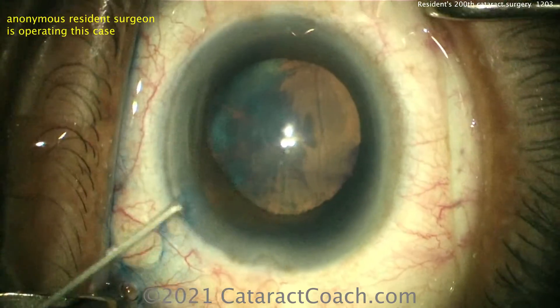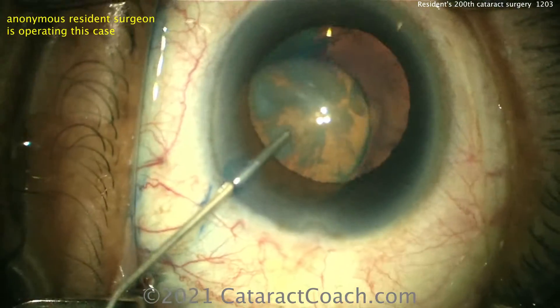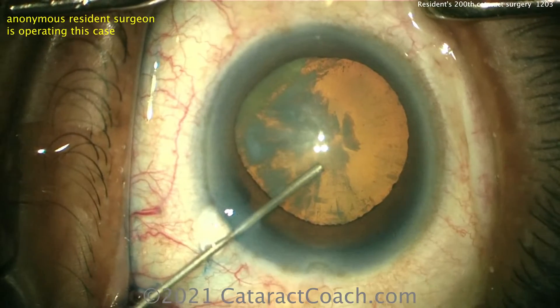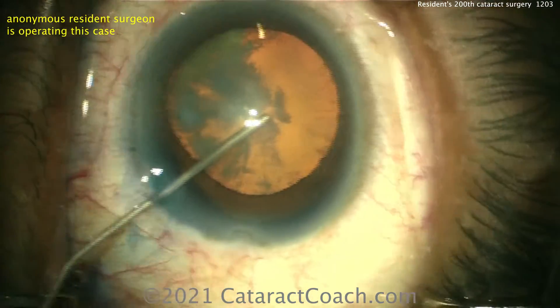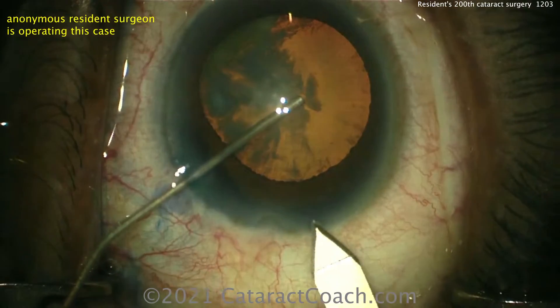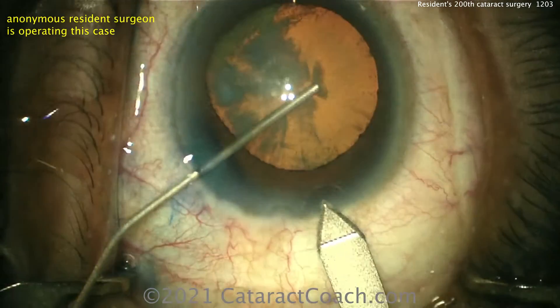Now here comes the viscoelastic. With a dispersive viscoelastic, I'd actually prefer you to go across the eye and backfill it, because then you're doing a good exchange — you're taking out aqueous or saline and injecting the viscoelastic. Now fixating the eye with that cannula and making the incision.